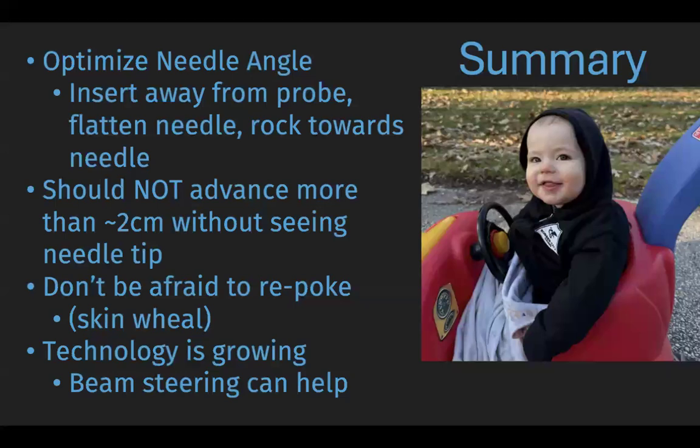And this is just a summary slide, and one thing is I feel like I haven't seen too many people use beam steering. So it's something else to consider and try to add to your toolbox, to help with your visualization. And I'd love to see what everyone else was doing and try to help their learners get good visualization to get their blocks in.